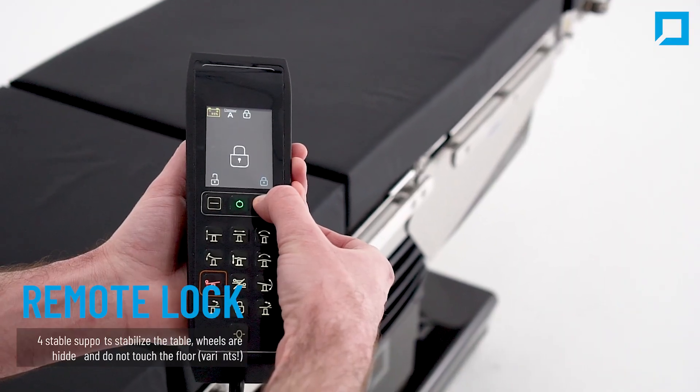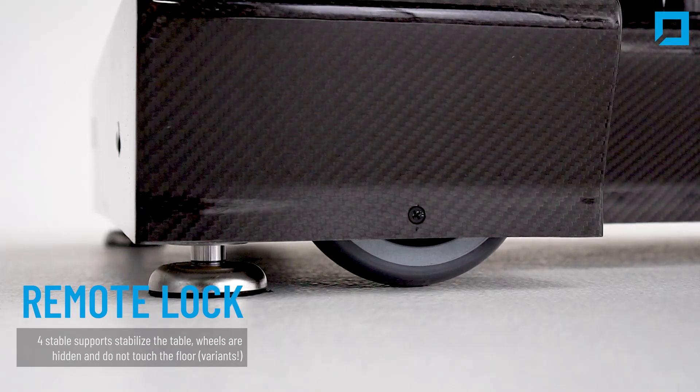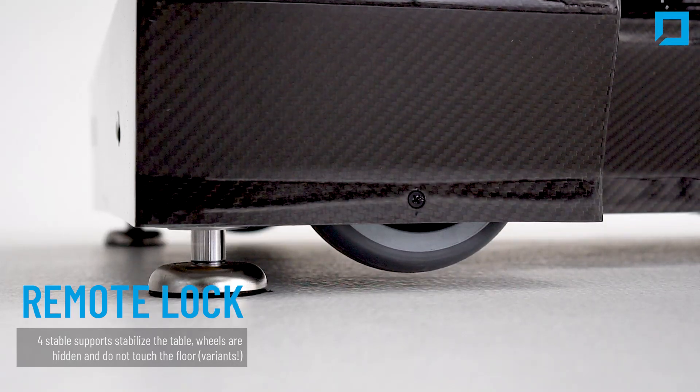The table can be locked from the remote control. Four separate feet stabilize the table, and the wheels are hidden and do not touch the floor.